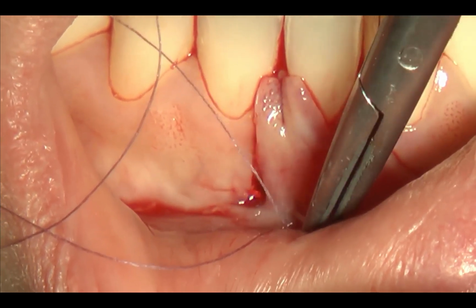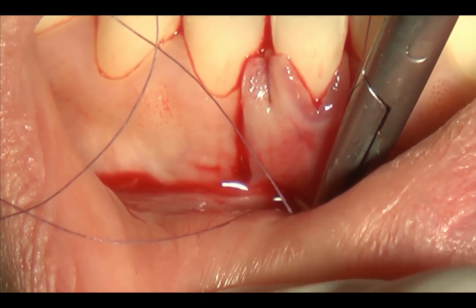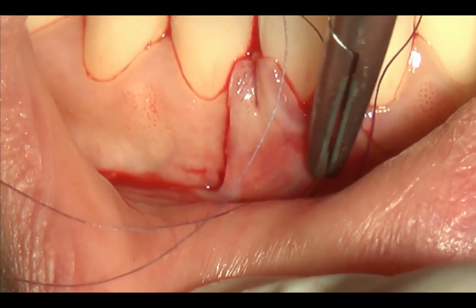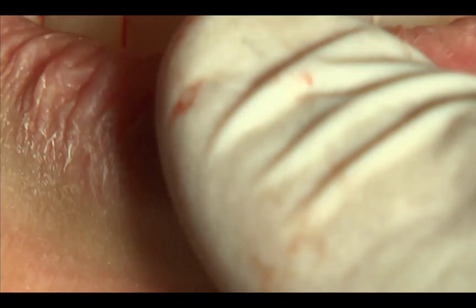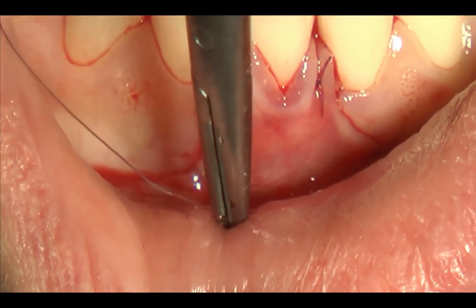No, sono sottili. Cioè, gli ho detto di tenere o di spirare?